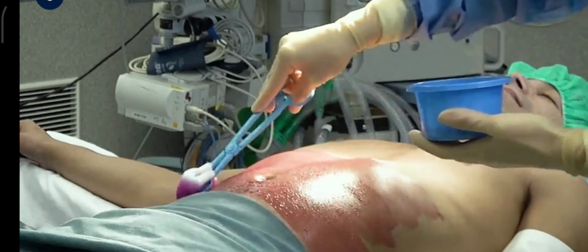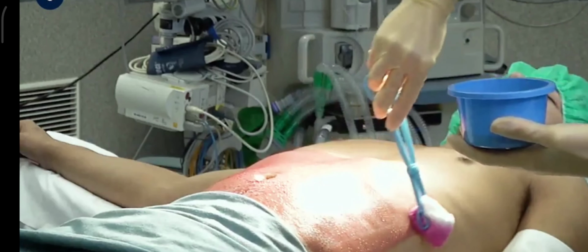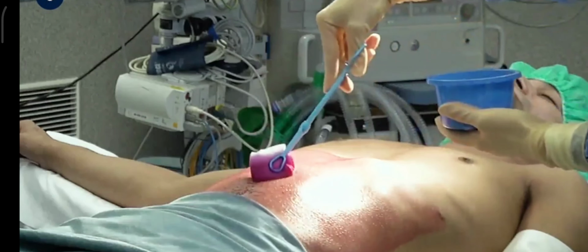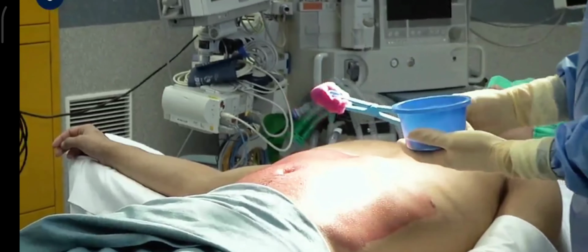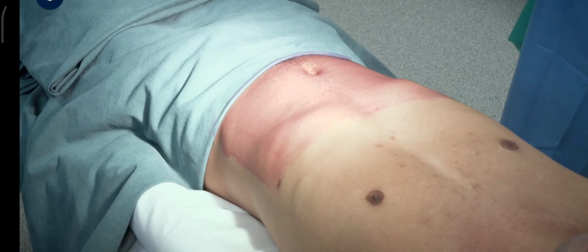Take note of the even movements of the clamp and that there is no splashing of chlorhexidine solution during the procedure. With skin disinfection concluded, the swab is disposed in the bin, while the clamp and container are handed to the circulating nurse. For this midline incision of the abdomen, a square draping configuration will be used.